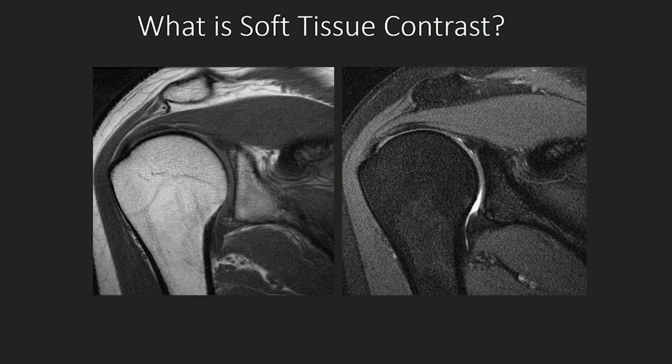So in general, it's really important to get comfortable with all three planes, and then to include all three planes in your analysis, because it'll make you that much better at not only picking up pathology, but making the correct diagnosis. So locally, wherever you practice, it's really up to the radiologist at that institution or at that site. But in general, three planes are standard, and three planes should be utilized when you're going through a study yourself.